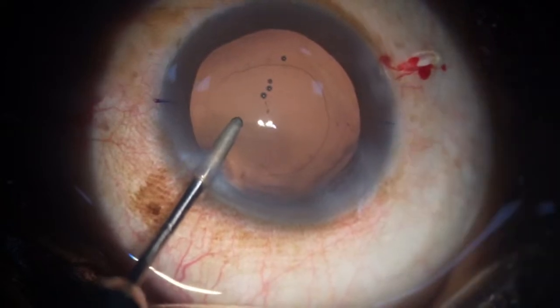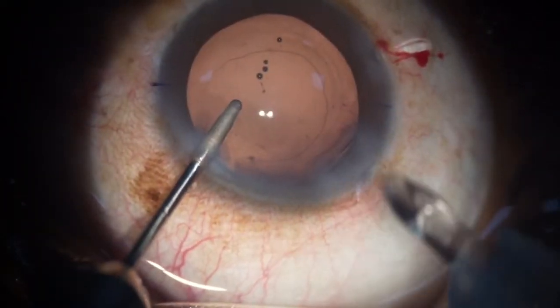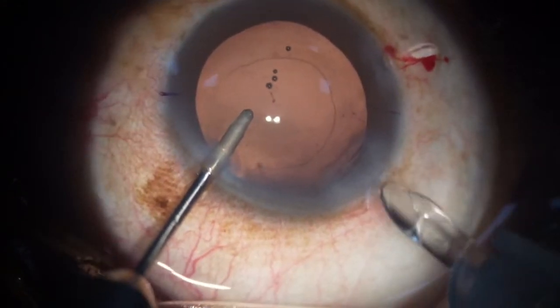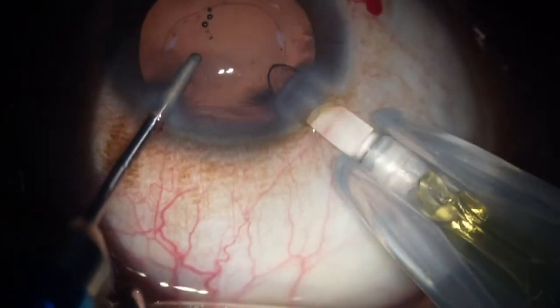So now I'm going to inject. I think Dr. Rajendra Prasad already showed you the injector system. It's an amazing injector system. I think it's the best in class. It becomes very predictable, and frankly, any patient requiring it.